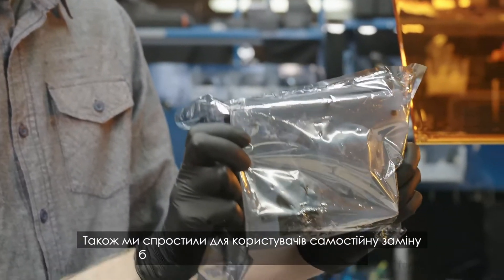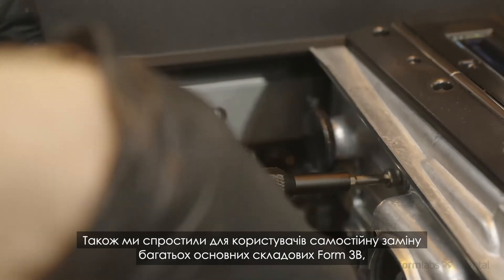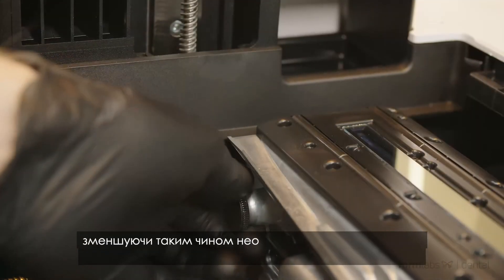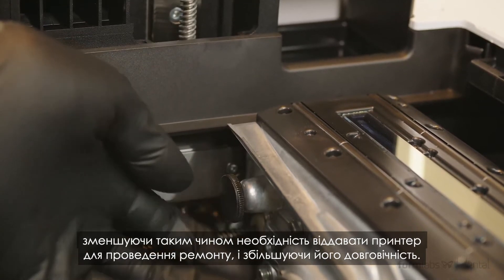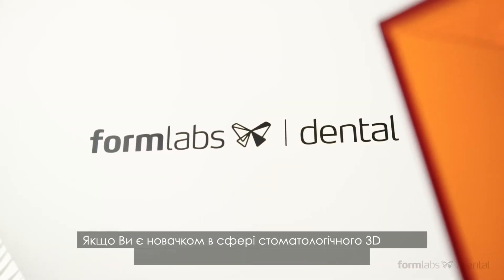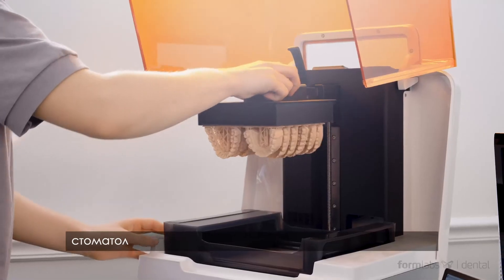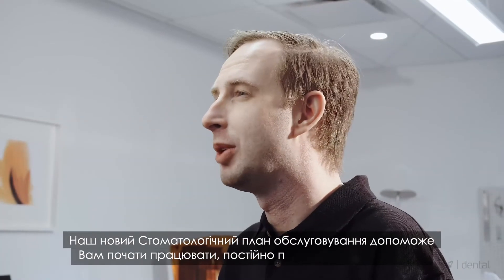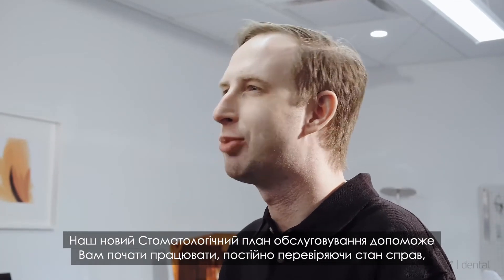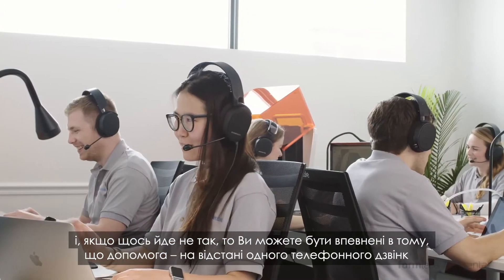We also made it easier for users to replace many of the Form 3B's major components themselves, minimizing the need to send a printer in for repairs and increasing uptime. And whether you're new to dental 3D printing or a CAD-CAM expert, the Formlabs dental team is here to help. Our new dental service plan will help you get up and running, check in proactively to see how things are going, and if anything goes wrong, help is just a phone call away.